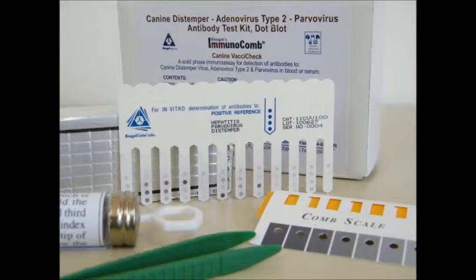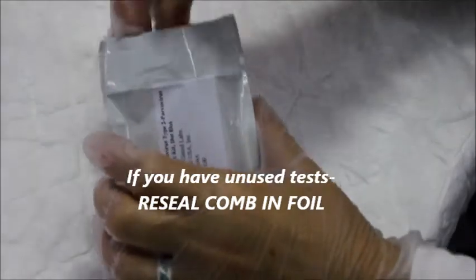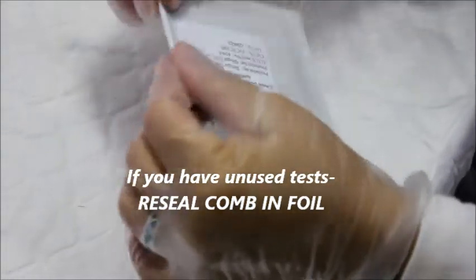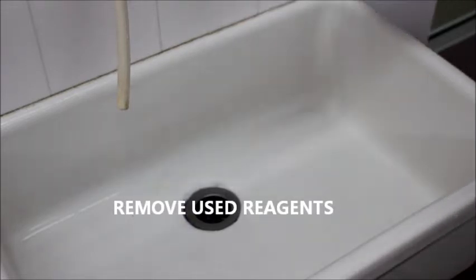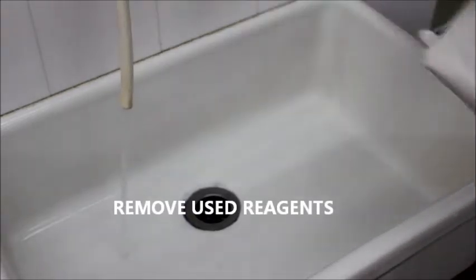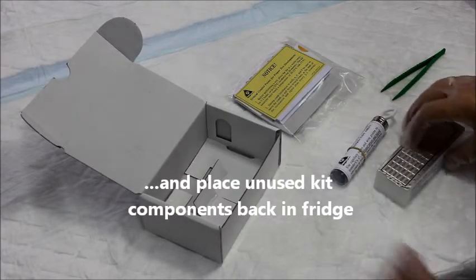Another way to read the results is by using the CombScan. This is a software program that utilizes a computer and a compatible scanner. This should only be used when very large volumes of tests are interpreted. Note that this interpretation is specific for the ImmunoComb Canine VaxiCheck Antibody Test Kit. If you are using a different ImmunoComb PET test kit, check the interpretation specific to that kit.